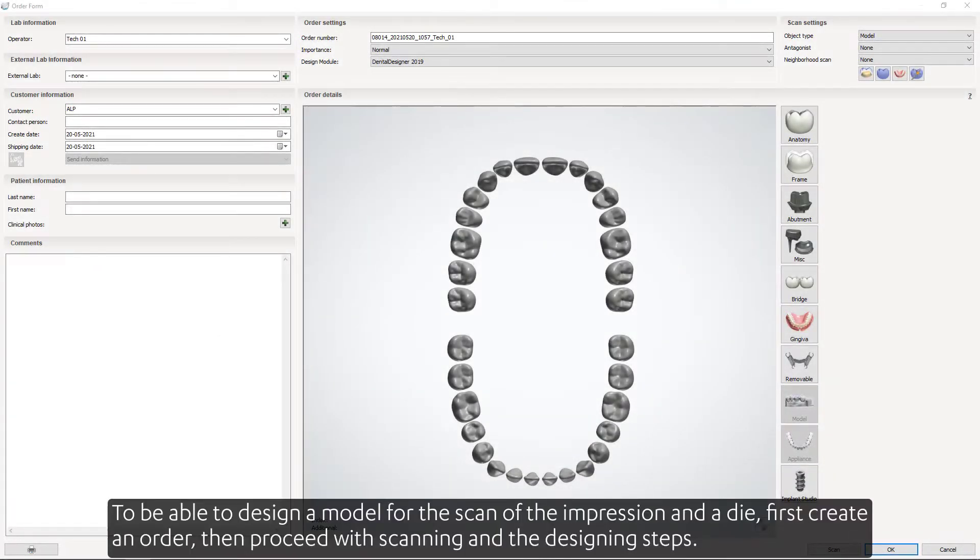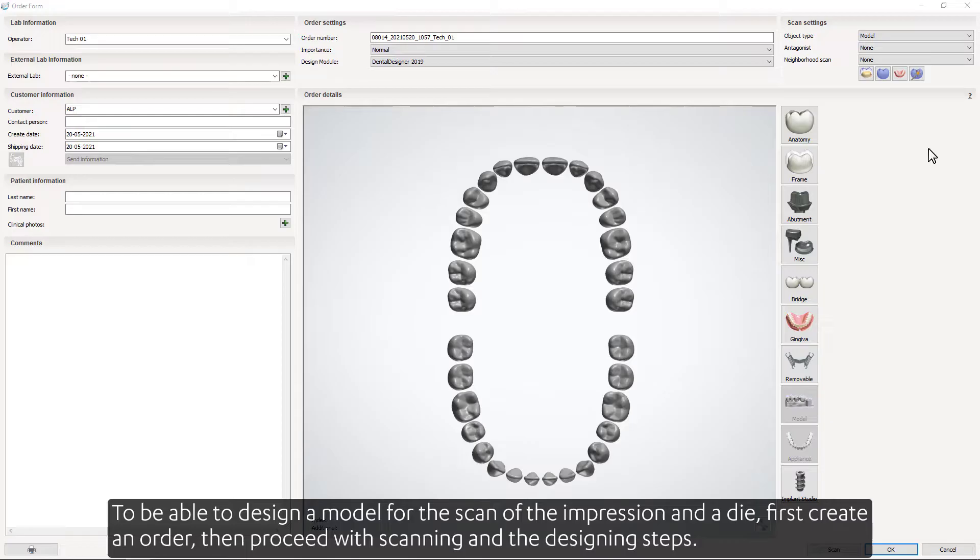To be able to design a model for the scan of the impression and a die, first create an order, then proceed with scanning and the designing steps.